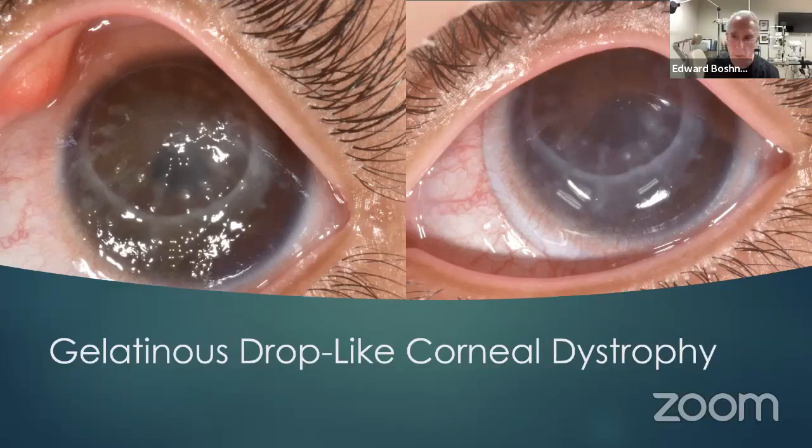Without the lens, the patient's visual acuity is less than 20/1000. With the scleral lens and eyeglasses over, the patient's able to identify around 20/70 vision. And his corneal surgeon says he's on a waiting list for another transplant in about a year.